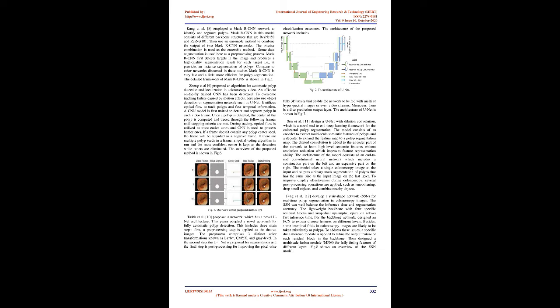Urban et al. 6 designed and trained a deep CNN to detect polyps using a diverse and representative set of hand-labeled images from screening colonoscopies collected from more than 2,000 patients. They trained different CNN architectures in this study. All trained CNNs consist of the same fundamental building blocks, including convolutional layers, fully connected layers, maximum or average pooling, nonlinear activation functions, batch normalization operations, and skip connections. Here each layer is followed by a rectified linear, ReLU, activation function. The last hidden layer is connected to the output unit and optimized with the loss, with linear output units for localization problems.